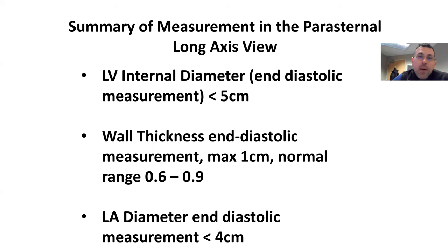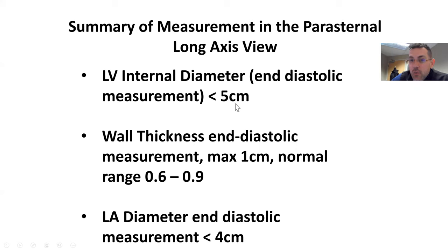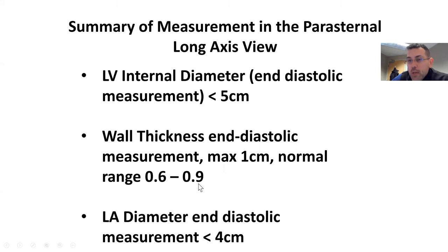To recap, a summary of measurements in the parasternal long axis view: left ventricular internal diameter, measured at end diastole, should be less than 5 centimeters. Wall thickness, also at end diastole — maximum is one centimeter, with normal range between 0.6 and 0.9. And left atrial diameter, again at end diastole, should be less than 4 centimeters.